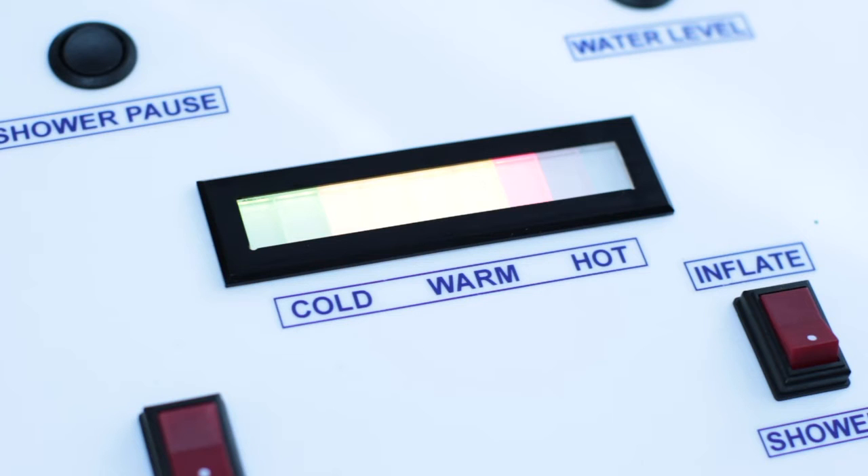Body temperature is indicated when the last amber or first red light is illuminated. If all the lights are lit, this indicates 40 degrees, which is hot but will not burn. Anything above this, an alarm will sound and a safety cutoff will not allow water out of the Watergenie.